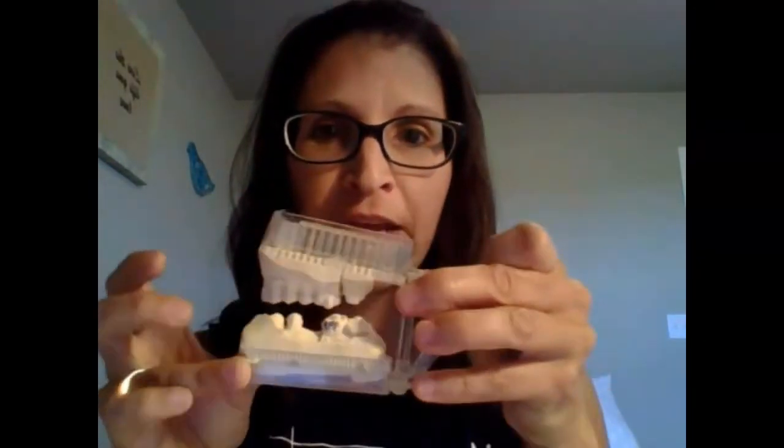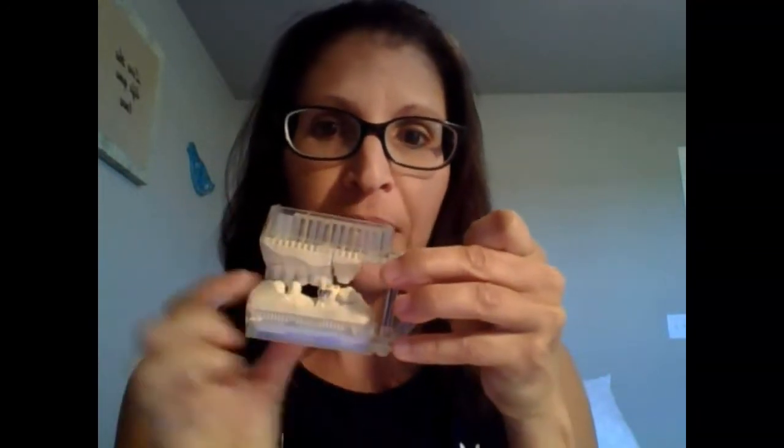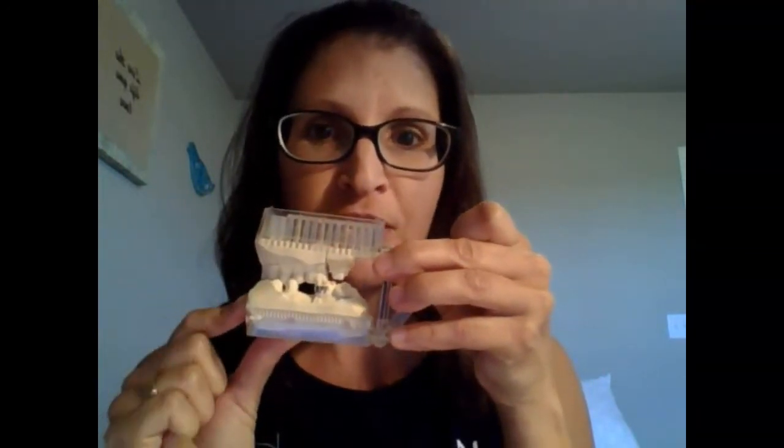And this again just helps, when they're articulating the model together, to see how the patient bites together. So as they're fabricating the crown, they know that it can fit, they want it to fit well. There might be some adjusting that still has to take place occlusally and interproximally, but they try to do it as minimal as possible.